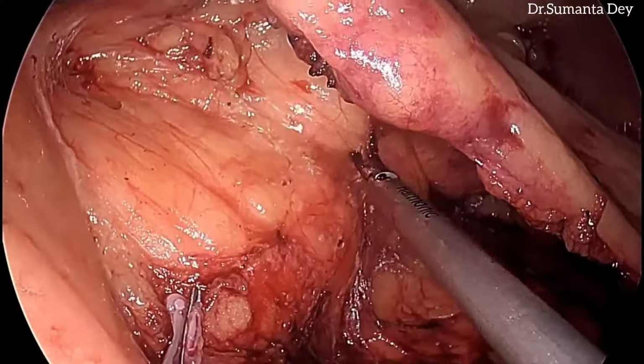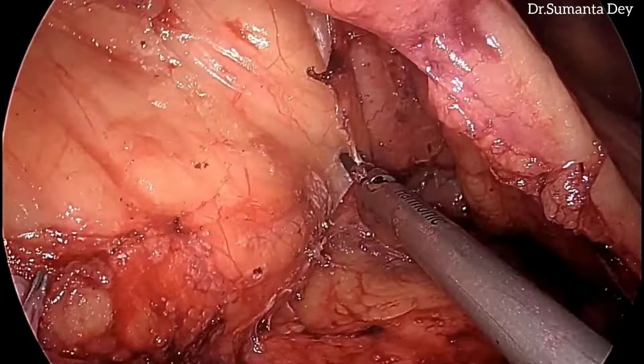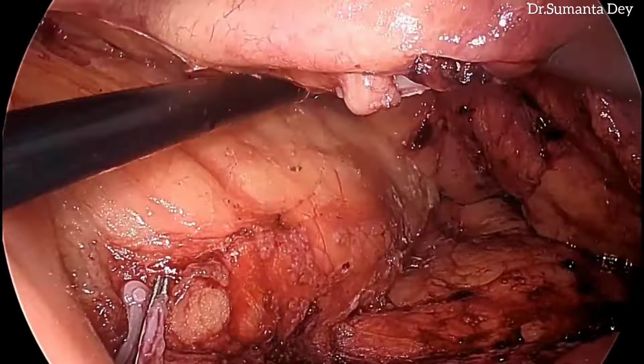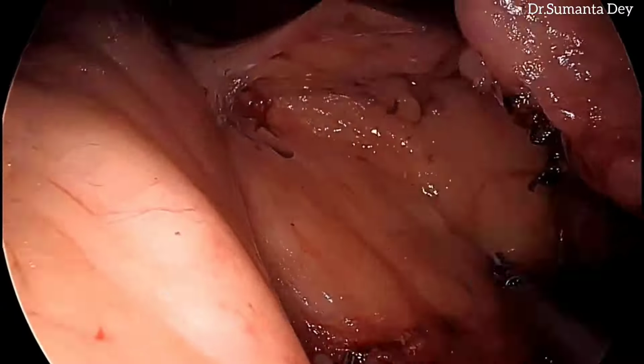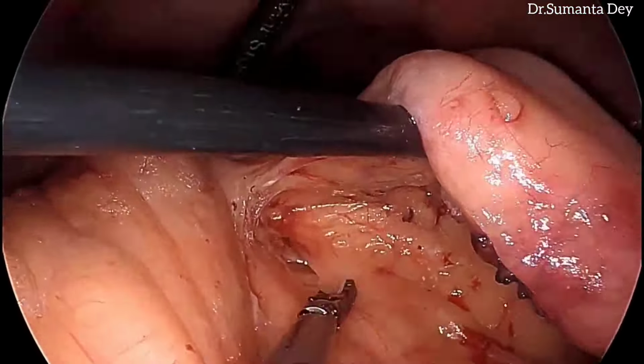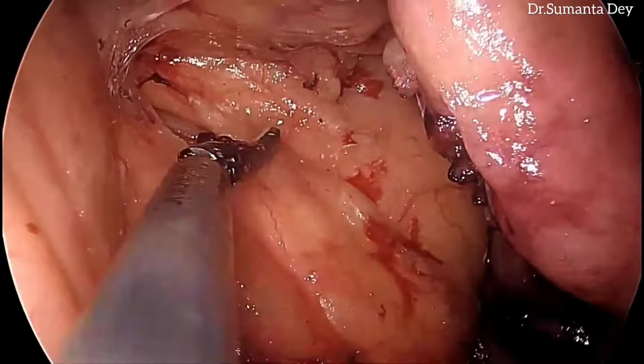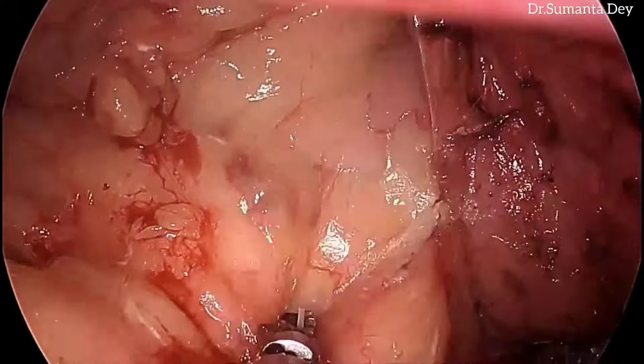So I have proceeded forward with harmonic dissection, and you can see the lower border of the pancreas and the body of the pancreas clearly, and gradually I am proceeding towards the tail of the pancreas. And now at the superior part of the pancreas, I have divided the fold and entered into the lesser sac.